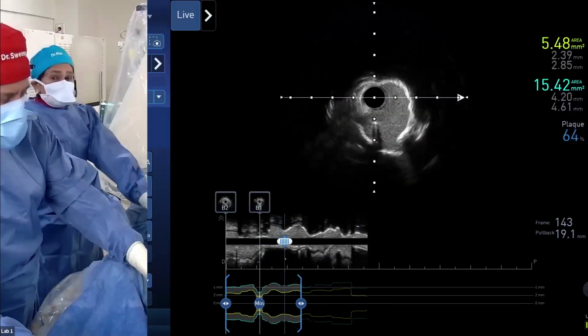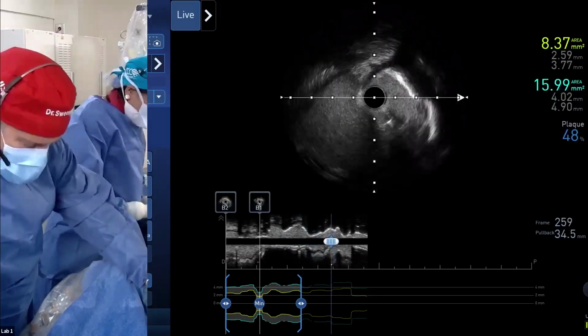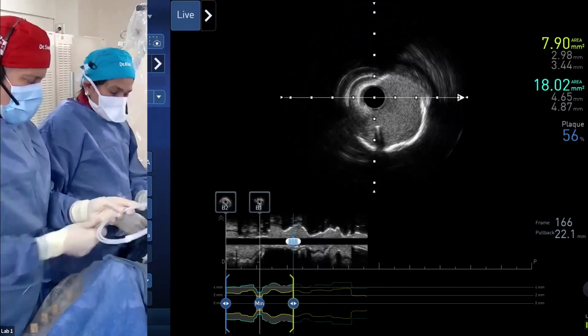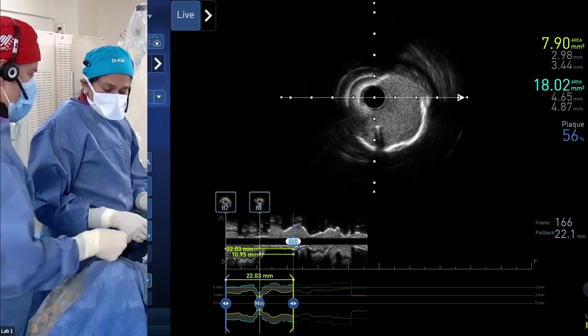He's saying go rota of the side branch. You can always say, why not? Okay. But this is an excellent example of where atherectomy is mandatory, really.